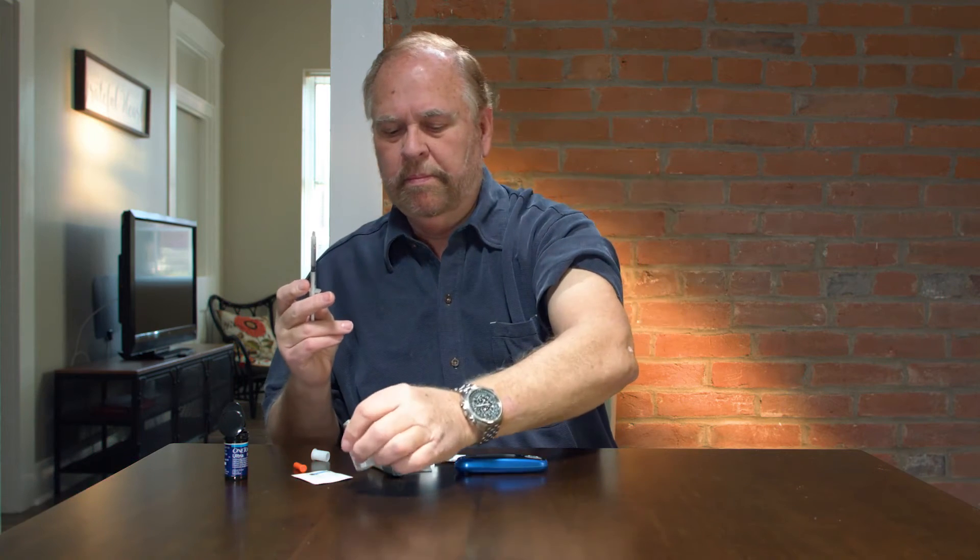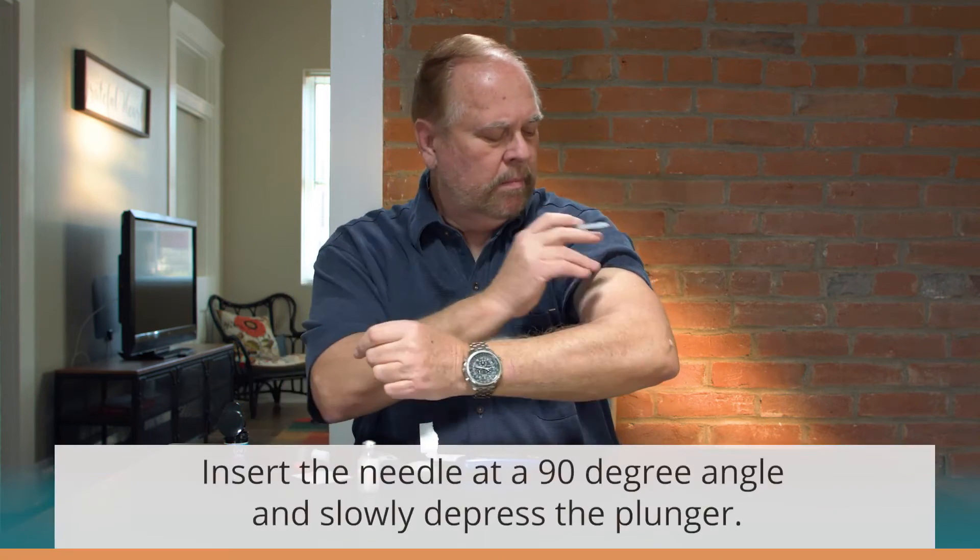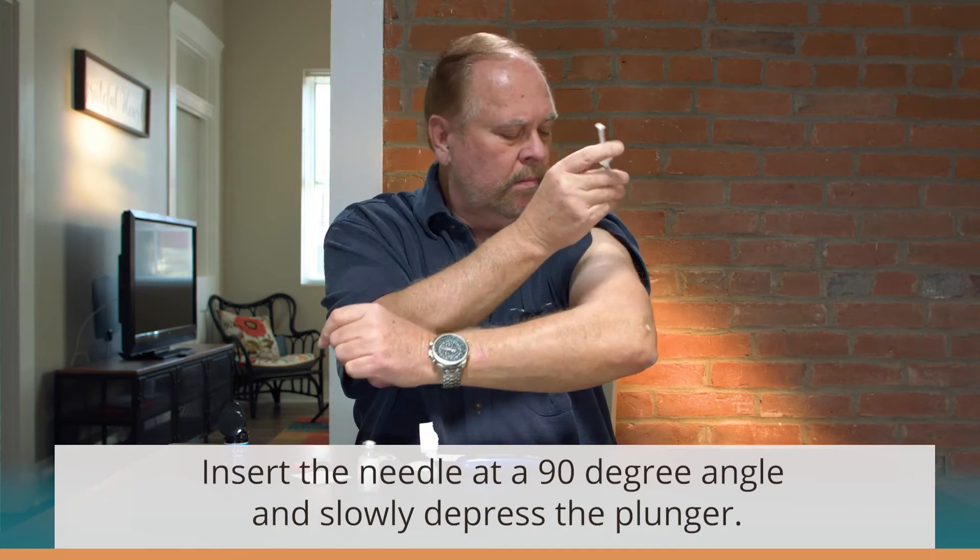When you have the proper amount in the syringe, insert the needle at a 90 degree angle and slowly depress the plunger.